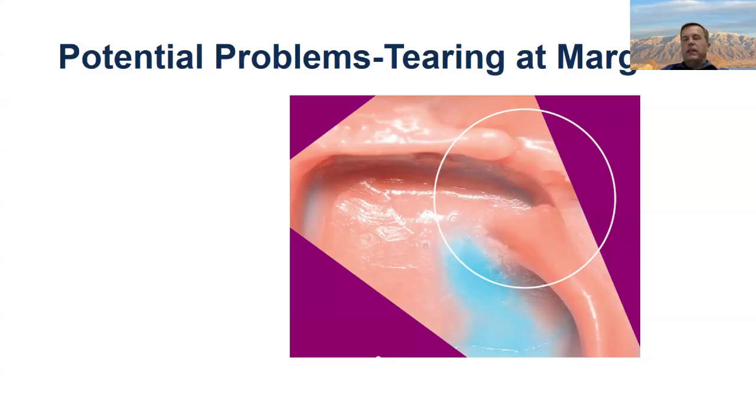So it gives us the ability to totally control our ratios and make sure that our models are hard and that they also have the appropriate amount of expansion. So in general, we have better equipment for pouring. The exception would be things that don't travel well, alginate, hydrocolloid, that sort of thing. We'd prefer that you guys pour those up.